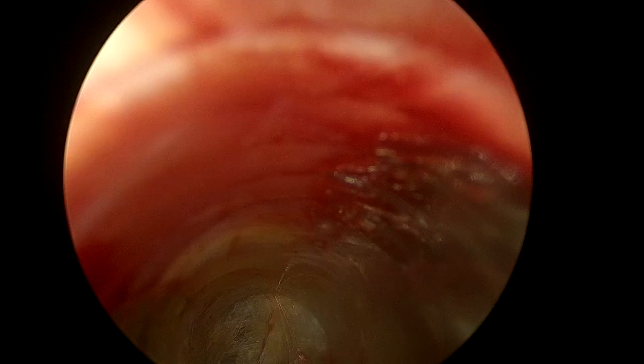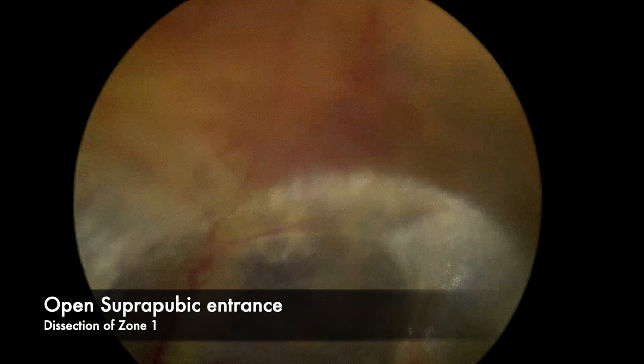In this case, I accidentally entered the retrorectus space. You can see there that I'm seeing muscle, which is something that hasn't happened before. So now I know I need to push downwards to be in the pre-transversalis, preperitoneal space.